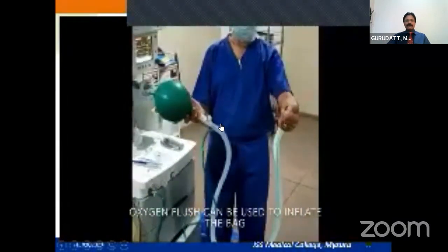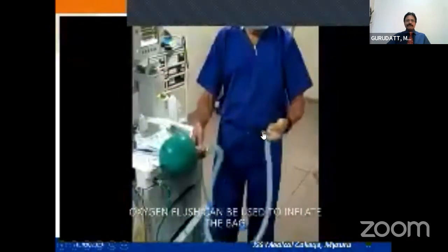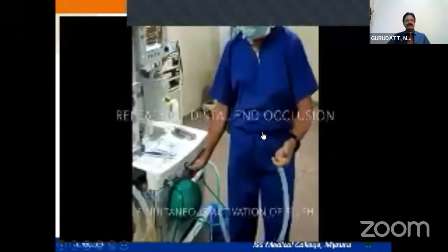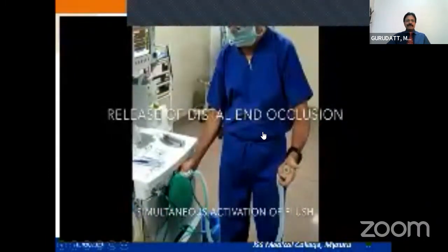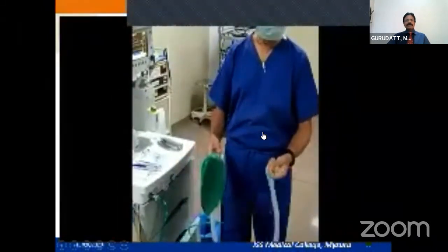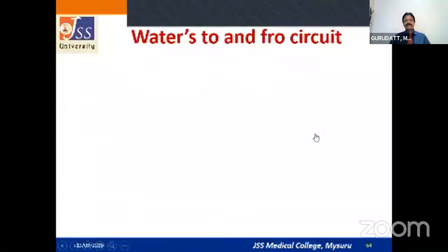And now I'll do two things simultaneously. I'll open my finger from the outer tube, and also I'll activate the flush. Just see, activating the flush and also opening the finger from there. See, the bag is collapsing. The bag is collapsing provided the inner tube is patent and the integrity is complete. So that's how you can always use this test. Many times you will be asked to demonstrate this test in the exam.